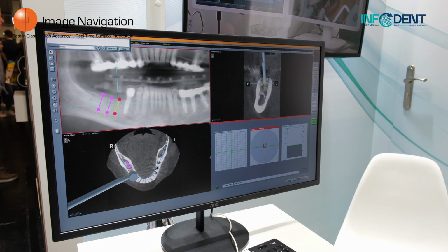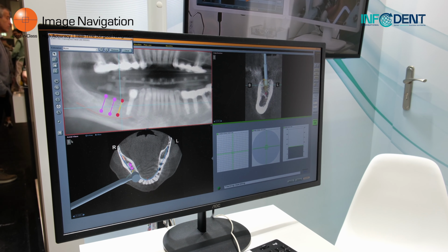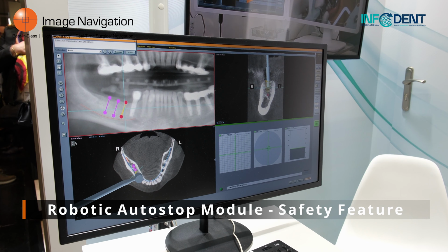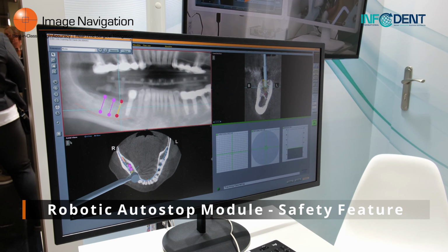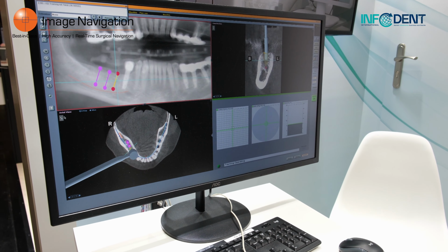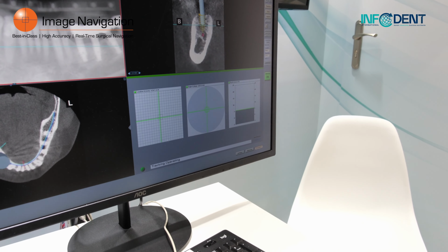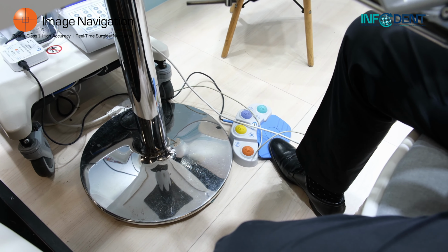The first feature that was added to the system this year is what we call the auto stop. We can see the auto stop tab on the right side panel, and when we are aligned to our target, which is represented by those green lines in the three indicators, we will see an upper green line that shows you that you're completely ready to go. And at that point, I'm going to press on my motor. I don't know if you can hear the motor running.